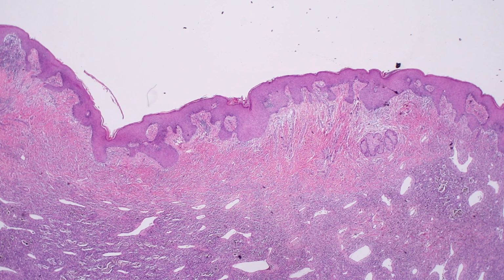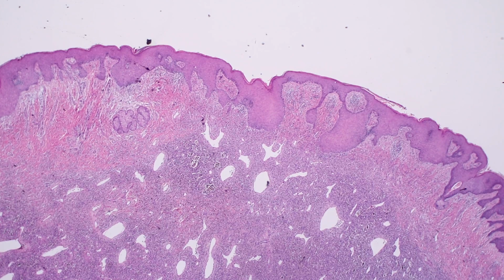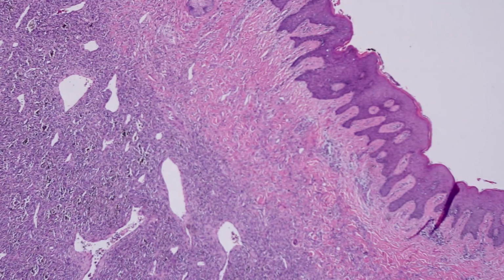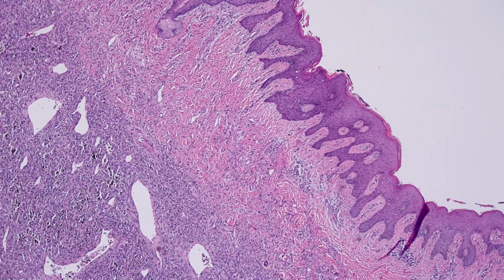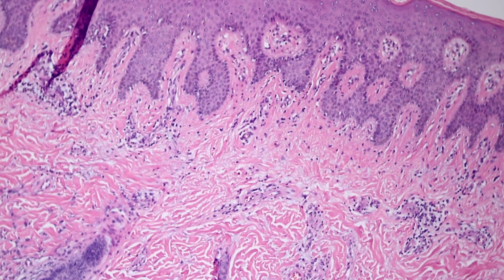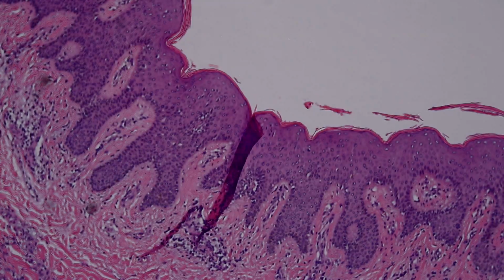We have nice epidermal hyperplasia over top, elongation of the rete, and maybe a little flattening at the bottom, but not too much. You can see here epidermal hyperplasia towards the periphery of the lesion, and as is often the case, you'll get some kind of hyperpigmentation of the basal layer. Well, I guess we don't really have that much of that here, but you'll sometimes see increased pigment of the basal layer, which goes along with the pigmented appearance that these lesions will have clinically.